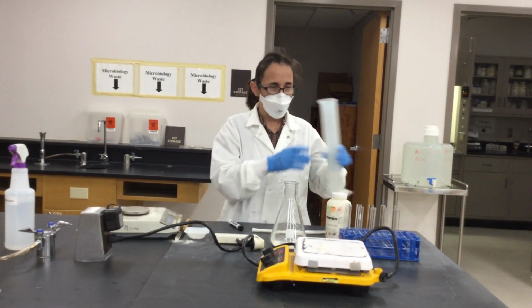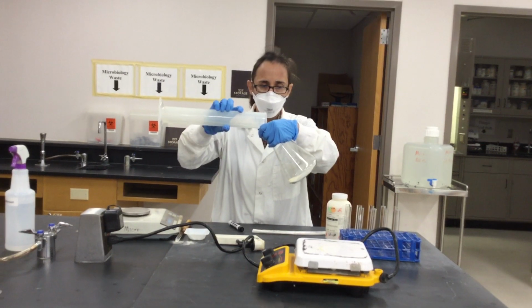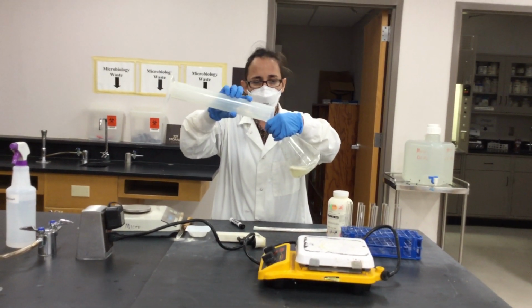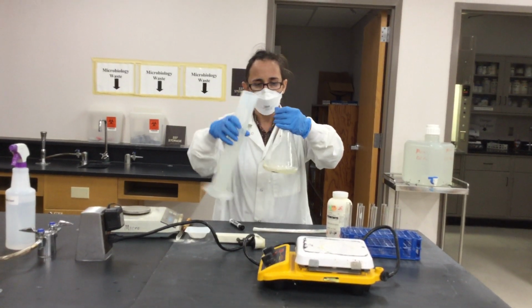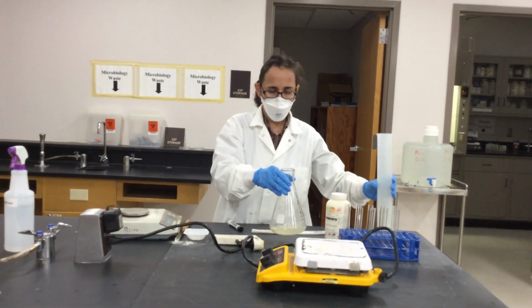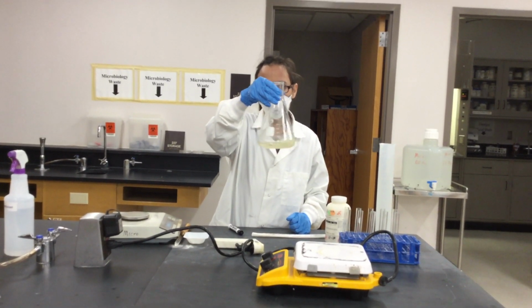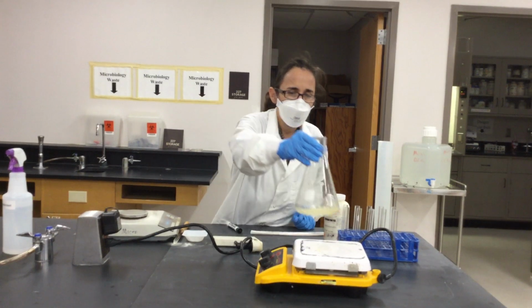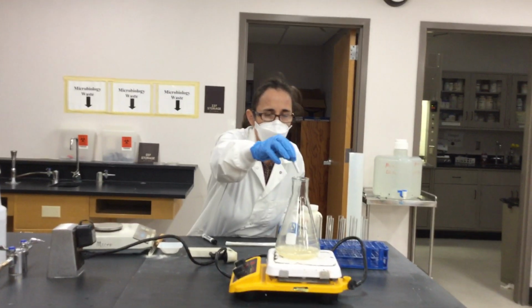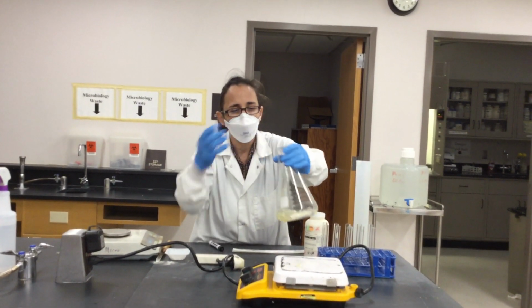And then you add your water, and when you add your water, add it kind of at an angle so you don't splash so much the water to the sides, and try to grab or humidify the powder from the sides. And this is very little media right now, and of course we just did this to know how to prepare media.